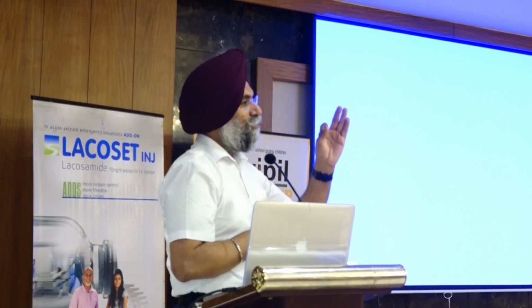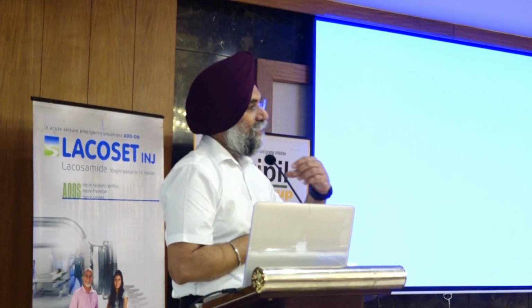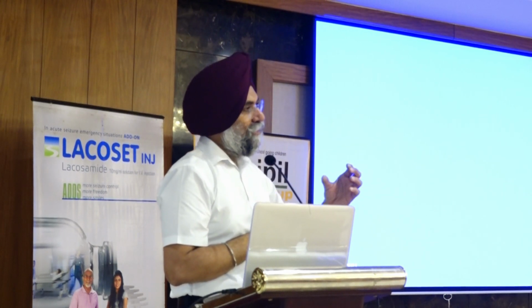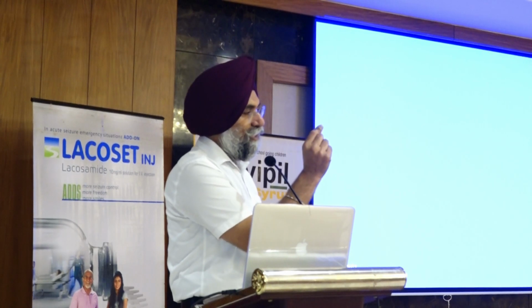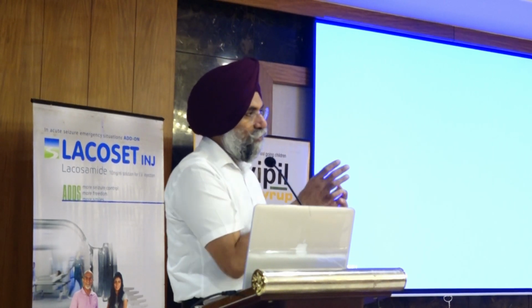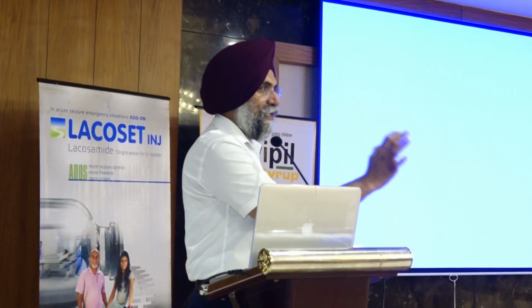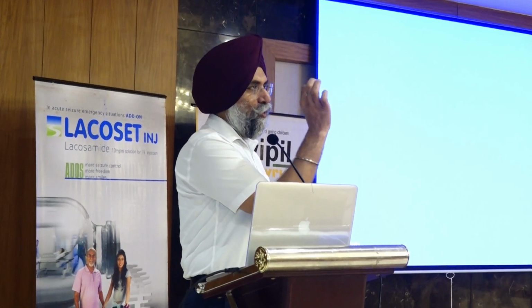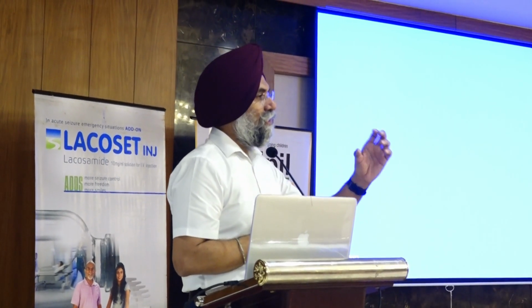So the thing is that we use only one collimator, which is around 3 to 4 millimeters anterior to the root entry zone of the fifth nerve. In the cisternal segment, you have to identify the nerve and then use around the 90% isodose line, so that we select the volume and then give it. It is a very small, tiny point volume, and actually we are damaging or destroying the nerve.